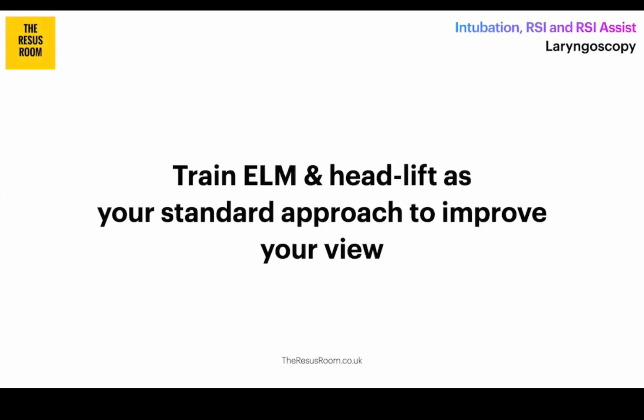So what we're saying here is that there are two things: there's ELM and there's a head lift. Really drilling these when you're practicing intubating, either on cadavers or on mannequins, is a really good thing to do, because you'll find it slips into your standard practice and then you really are optimizing your first view. Yeah, very impressive. Good stuff.